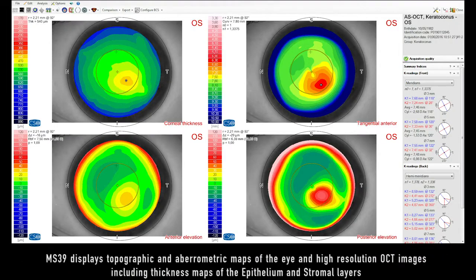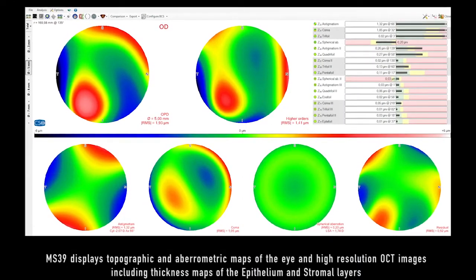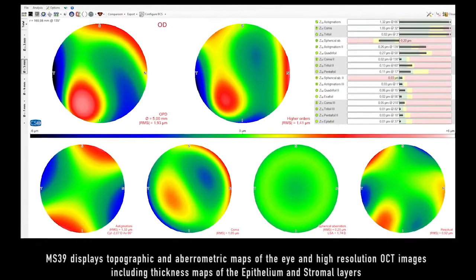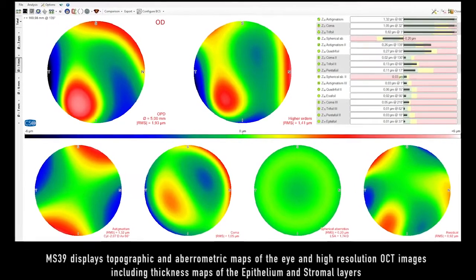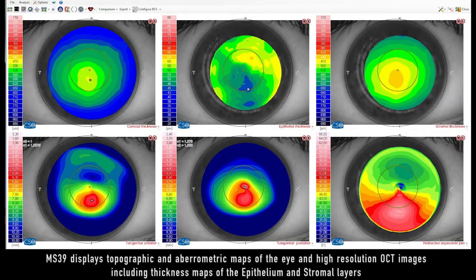MS-39 displays topographic and aberrometric maps of the eye and high-resolution OCT images, including thickness maps of the epithelial and stromal layers.